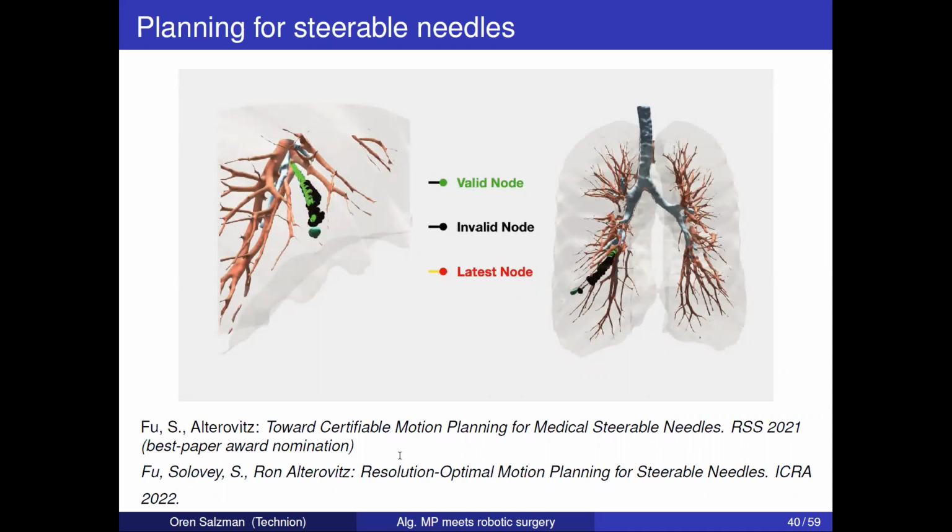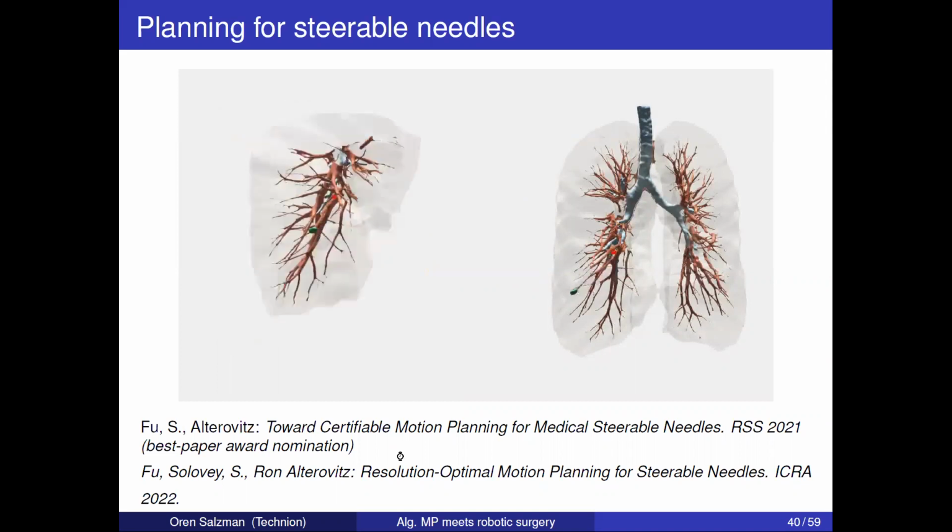I don't have time to dive into the technical explanation of resolution optimality here, but we can also give guarantees on the quality of the solution. And here we can see the planner in action applied for accessing a nodule within the lung.